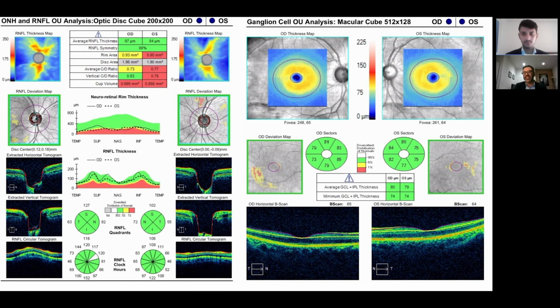But again, at this point, the patient already had her LPIs, pressures of 21. For the most part, the OCTs are looking pretty good at this visit in 2016. So I think it's worthwhile for us to carry on and follow her. I was not at a stage where I figured it would be worthwhile to start a patient on medications at this point, because for the most part, things were looking relatively robust.